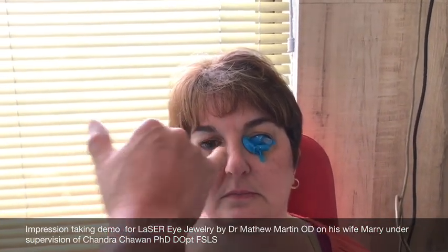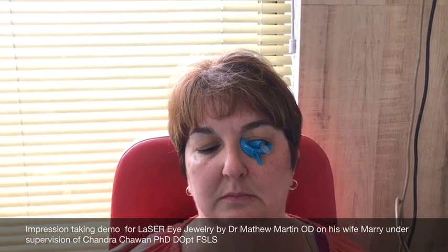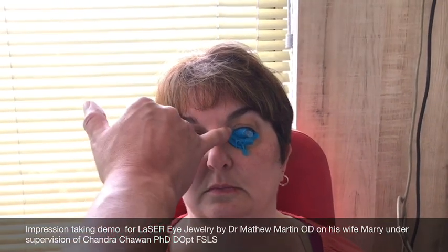Check it — not quite there yet. Look to the right for me Mary, then look towards me, then look down at the floor, and then I'm going to have you look up at the ceiling as well — excellent. Look straight ahead again if you would — perfect. We're closing in on the time to remove it, but it'll be just a few seconds longer, almost there.